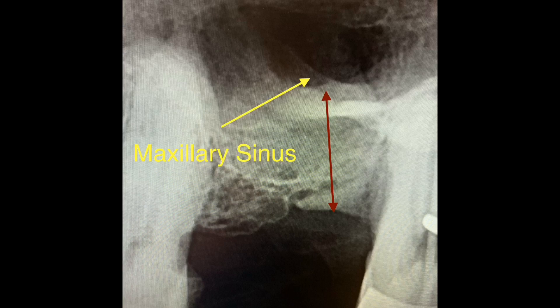This radiograph may present an exam question about the type of radiolucency pointed by the yellow arrow. You can identify it as the maxillary sinus, but keep in mind how far it extends posteriorly and anteriorly, as you may need to differentiate it from other conditions. The red arrow indicates the thickness of bone remaining after a tooth extraction, which could be a complication when a prosthetic device such as an implant is planned.